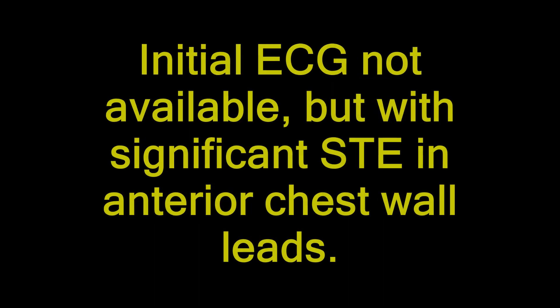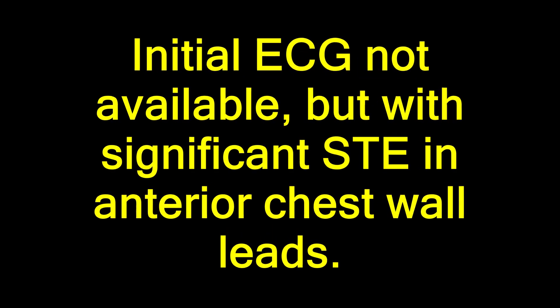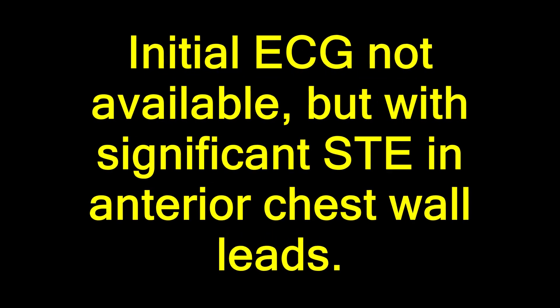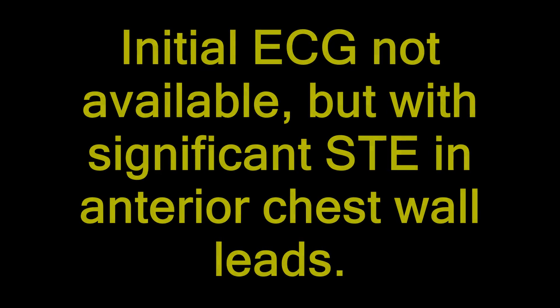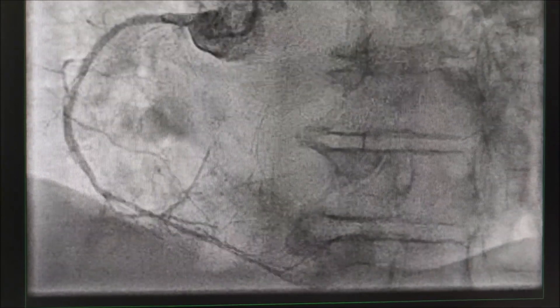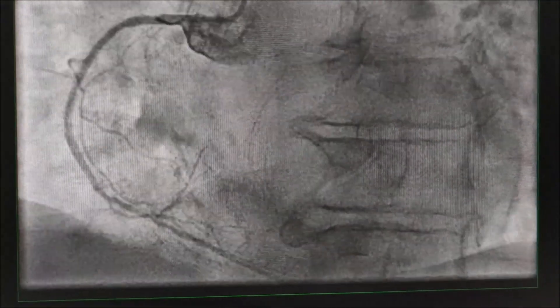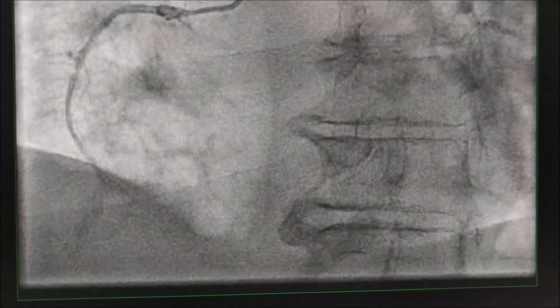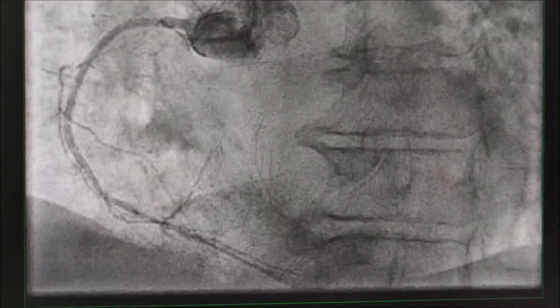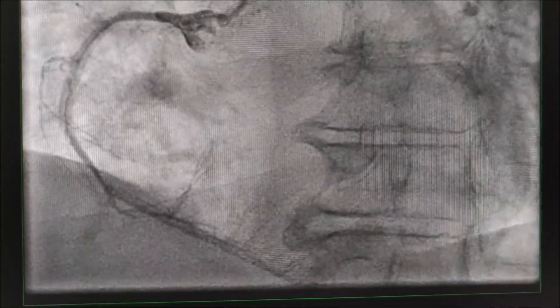The initial ECG showed ST elevation in the anterior chest wall leads. Here is her initial coronary angiogram. As you can see, the right coronary artery is well-developed from the proximal to distal part without any significant stenosis. There are also collaterals from the right coronary artery to the left coronary system.